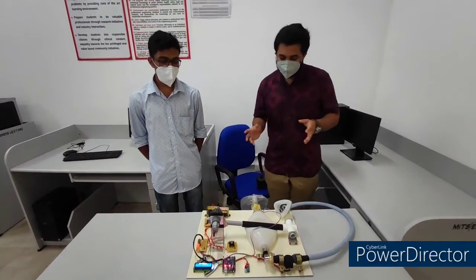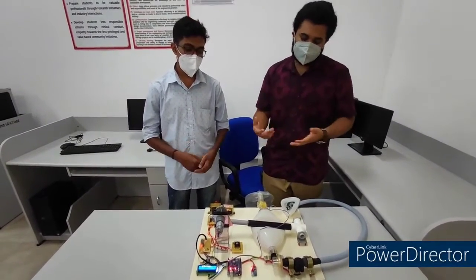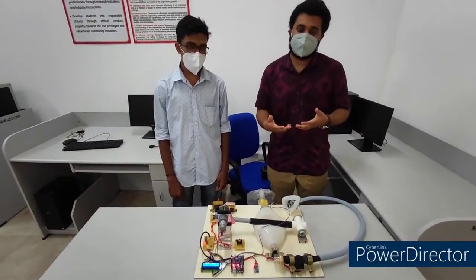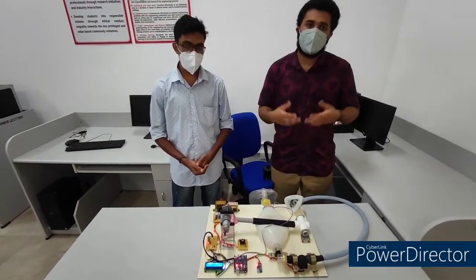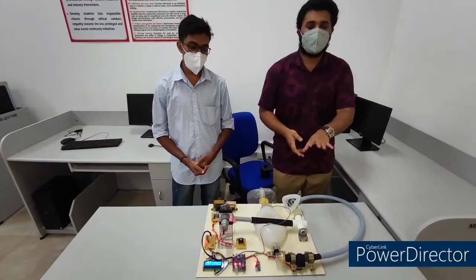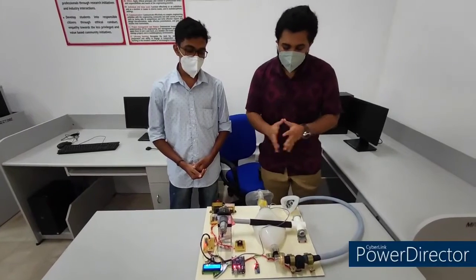Coming to the working of this ventilator — it has a mechanically controlled compression unit which compresses and delivers pressure to the patient. The unique feature of this ventilator is automatic mode switching. When the patient is in passive mode, meaning they are severely ill and unable to breathe, the system automatically activates sensor-based operation. Once the sensors recognize that the patient is recovering, it automatically switches to active mode. This is the unique feature of our project.